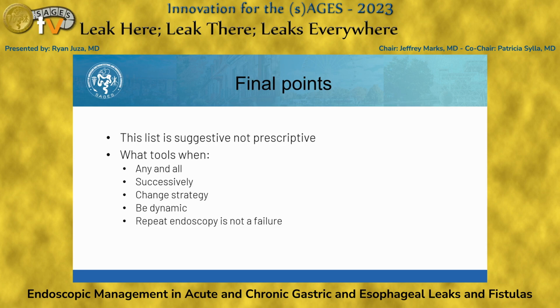And then just final points. This list is suggestive but not prescriptive. What tools to use are any and all that we've listed here. You can use them successively. Change your strategy. Don't be afraid to be dynamic. And repeat endoscopy is not a failure.